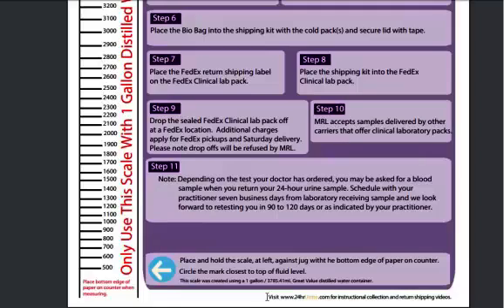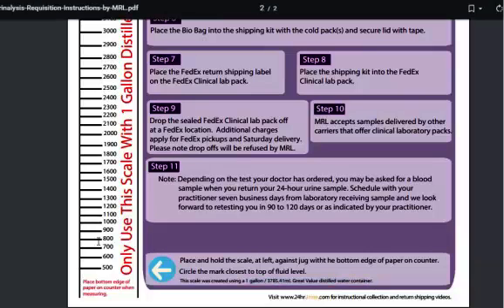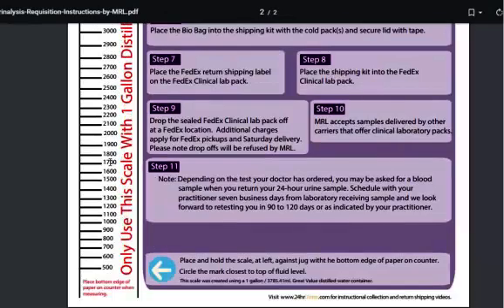I'm not sure what jug or what standard they used, okay? There are other ones that you'll find out there on collecting volume in a 1 gallon. Well, this is the 1 gallon we used, and we check it all the time. So if there's an update, we'll update it. But this is accurate. You want to have an accurate total volume. Some of those other scales out there are off by 500, 600, 800 milliliters.